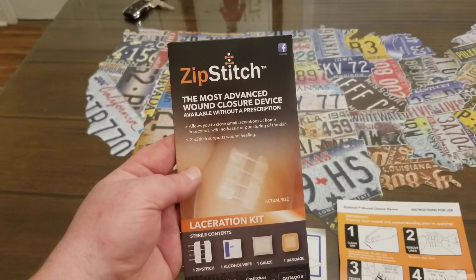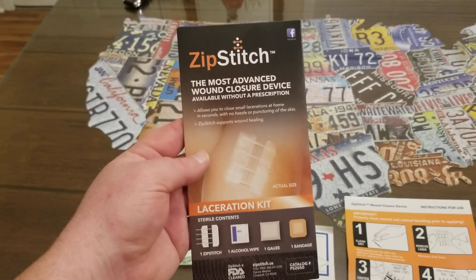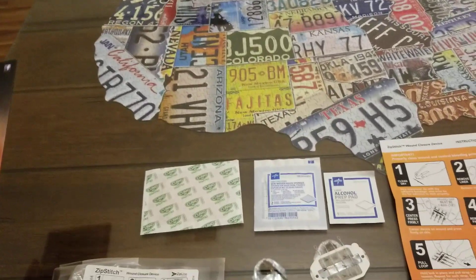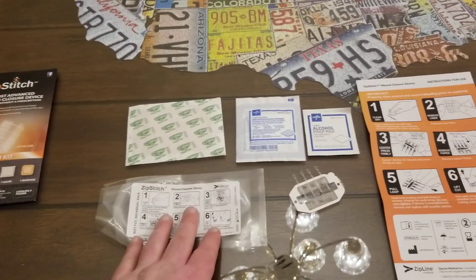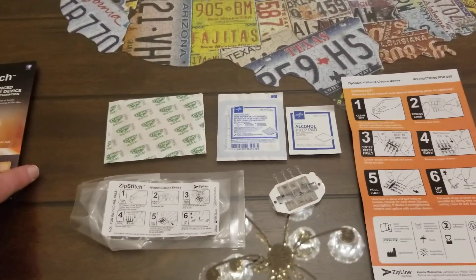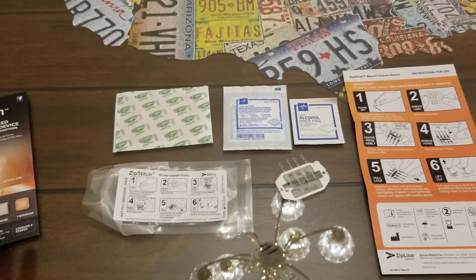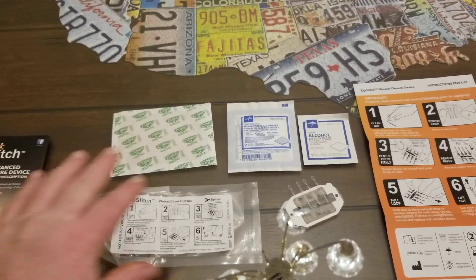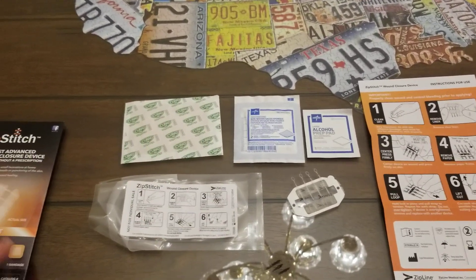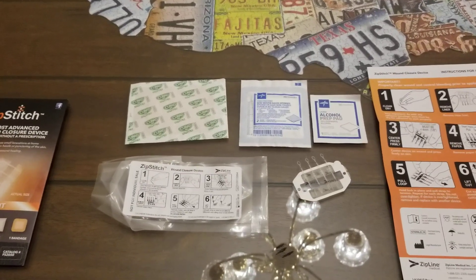This product is 12 times stronger than stitches, which is pretty incredible. Everything you see here on the table is what comes inside the envelope. It doesn't take up much space at all — you can see it's thin, and even with all the products inside, it's still about the size of an envelope.